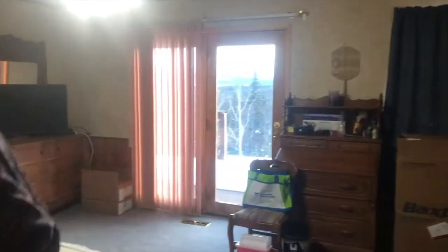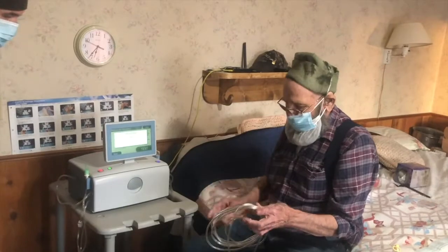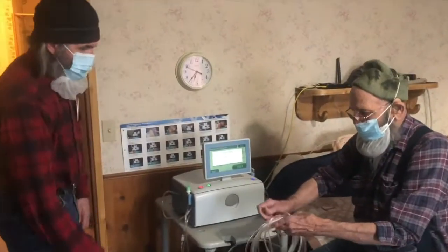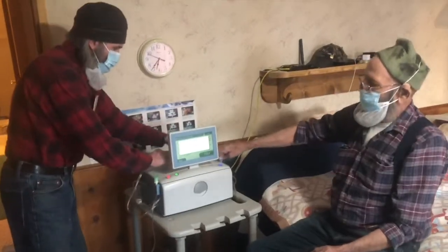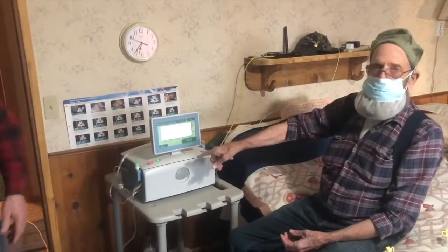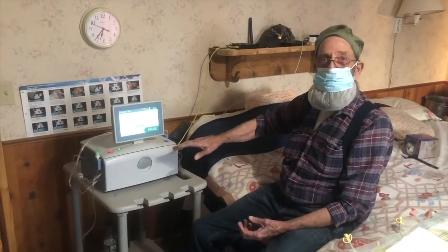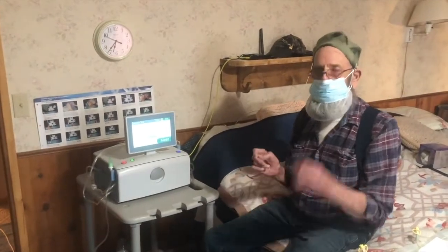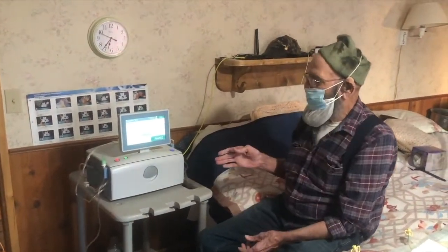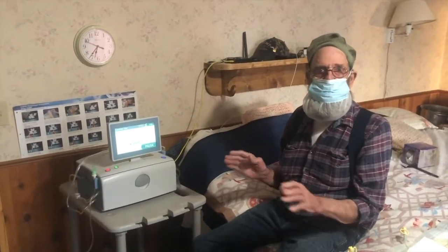And then after we got this thing this far along, it's going to be testing. I take this and lay it up on top of this, and it gets a little heat from that bag filling. Testing the cassette. Please wait. It's testing the cassette right now. If that cassette has a problem, this machine will catch it and it won't let me do my thing. We'll have to start it again.